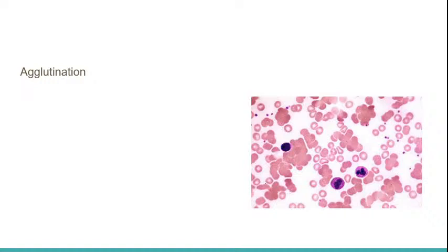I didn't visibly see it, but there is a flag on the automated analyzer that there is a false decrease of RBC counts and a false decrease of platelets. This will give me an indication that something happened in the cell. So when I made the smear, this is what we saw.